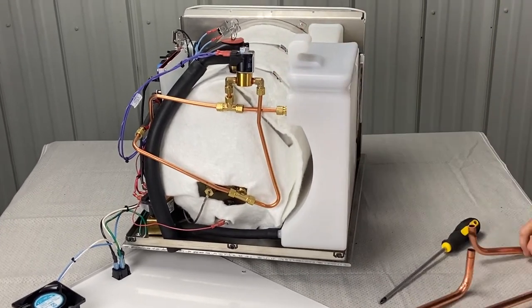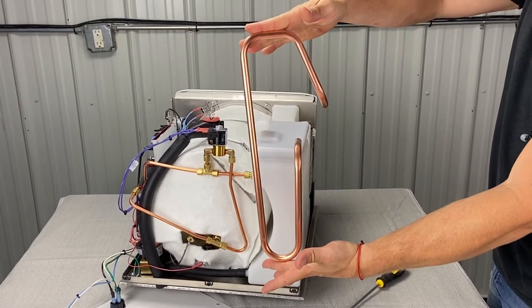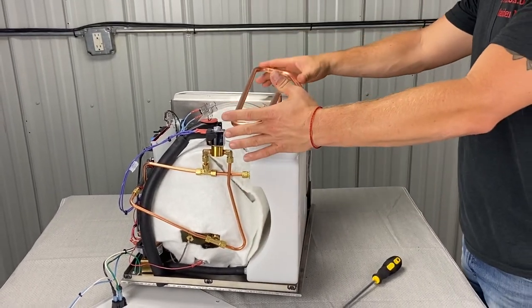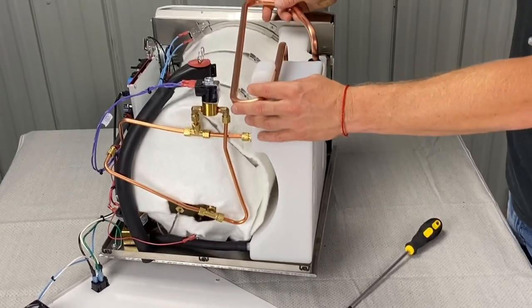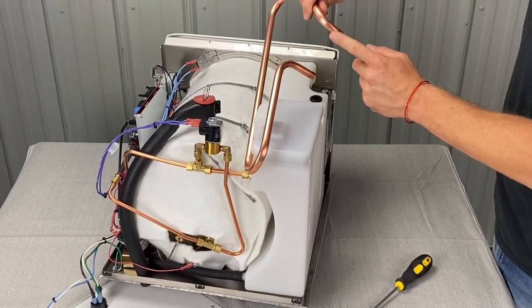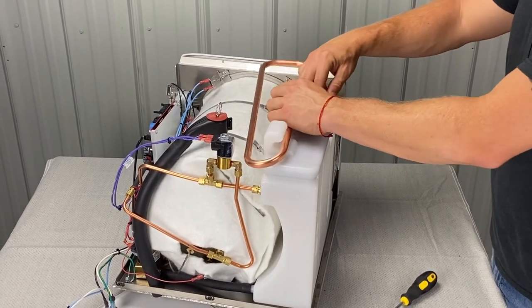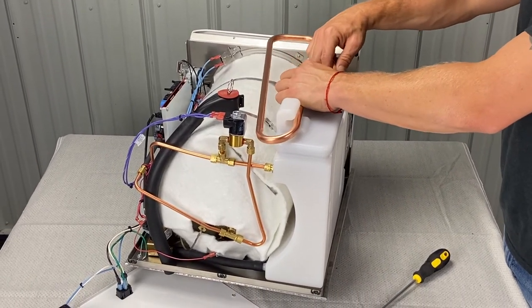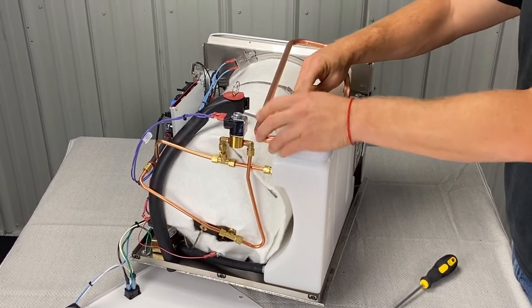After we put that on, we're going to take this copper coil here. This is how it goes from the back — slide it in place. If you start at an angle, you can get it kind of under here, and then these two pieces fit into two rubber grommets over here. Put one in, put the other in. Be careful not to push the rubber grommets down into the reservoir.